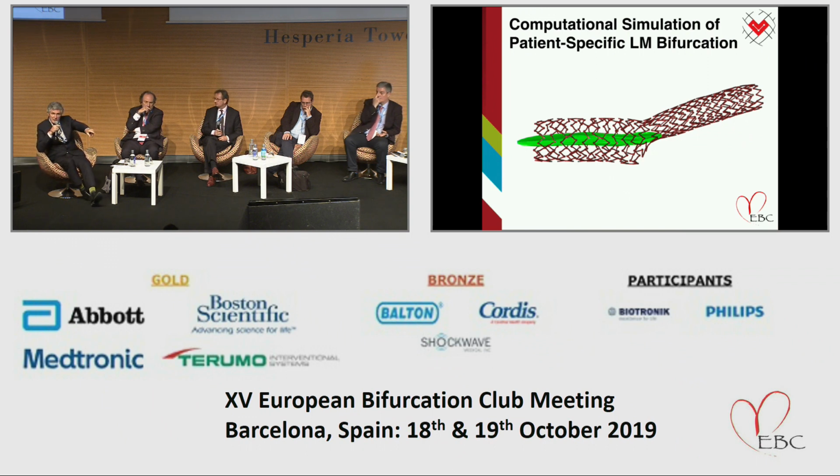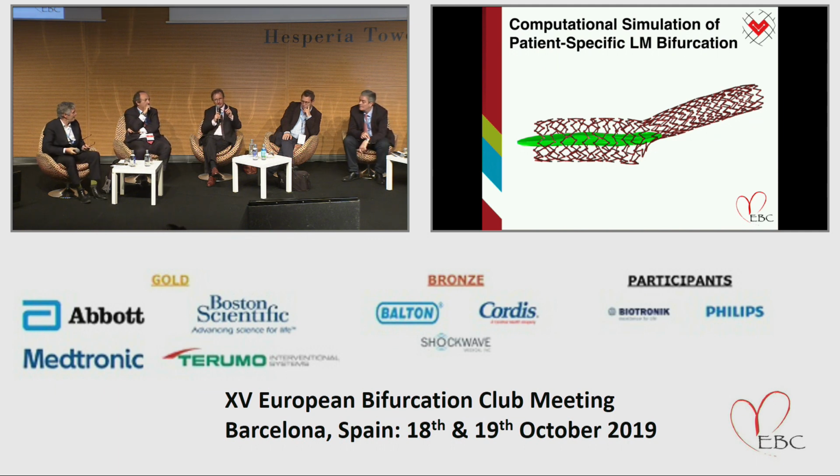But with this stent, you have 3 connectors at this level and 4 at the proximal part. So you have really high radial strength at this level for the ostium, and you need this because you know that there is a lot of recoil at the ostium of the left main. Thierry, another important information is you can go with Megatron up to 6 millimeters, not 5, 6.